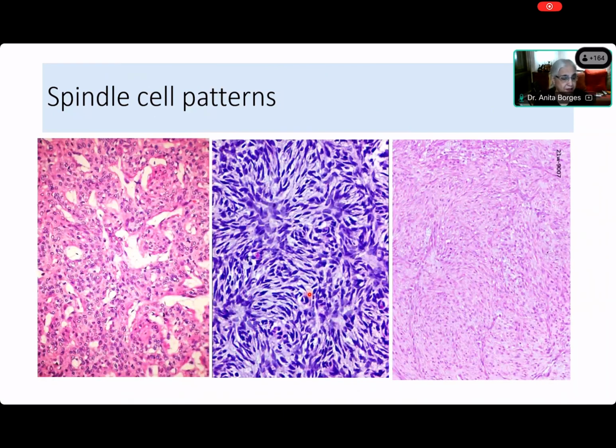There are some more spindle cell patterns. Now that you're on there, Kedar, can you tell me what is the pattern on the left? It appears to be a cartwheel pattern, ma'am. Oh, I'm talking about this. Is this cartwheel? You know what I'm talking about now, Kedar? I'm talking about the leftmost image, ma'am. Yes, the leftmost area. This one. Okay, so what is the pattern?